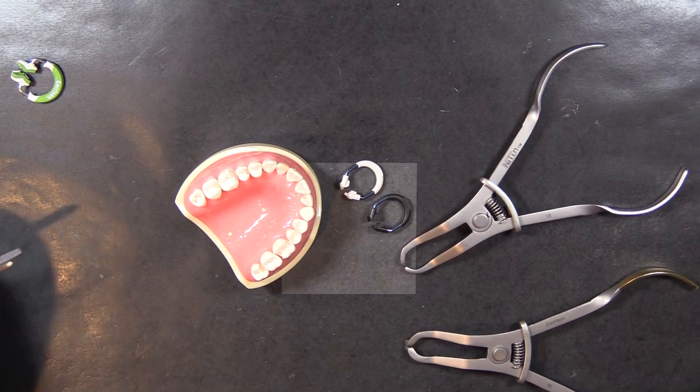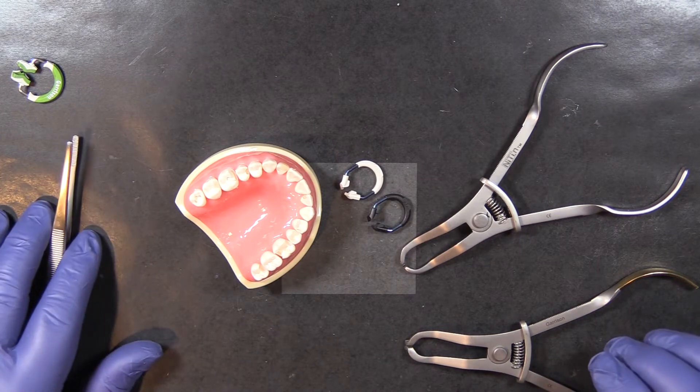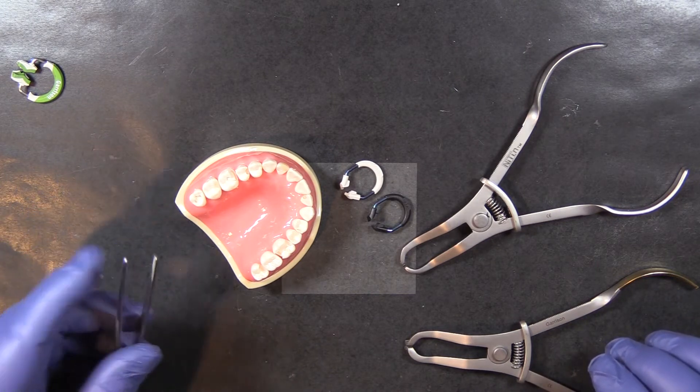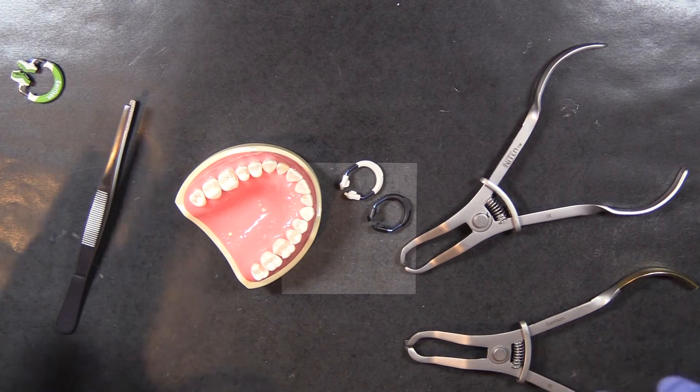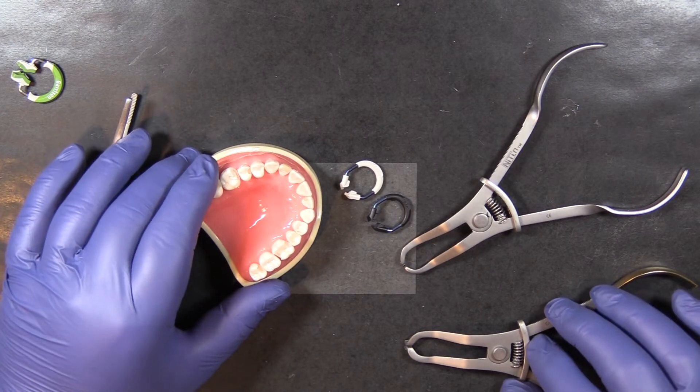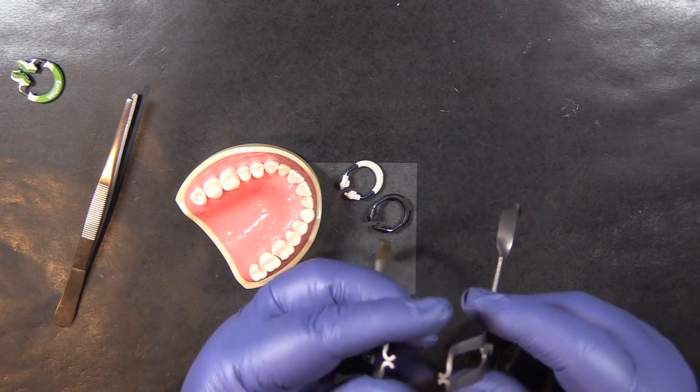Hi everyone, this is Kevin with Garrison Dental Solutions. I want to show you the Nitin ring placement forceps and band and wedge forceps today, as opposed to the Composite line of instruments. These things look so similar, but the tips are a little bit different.